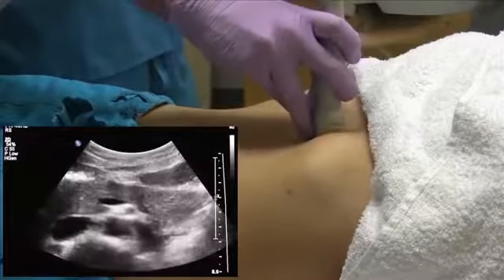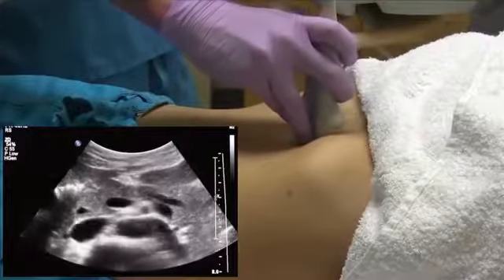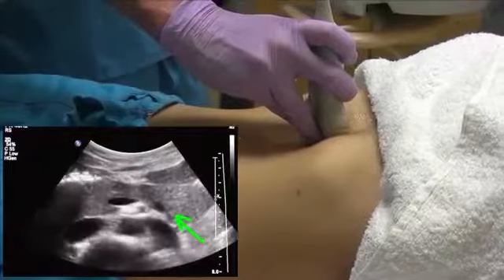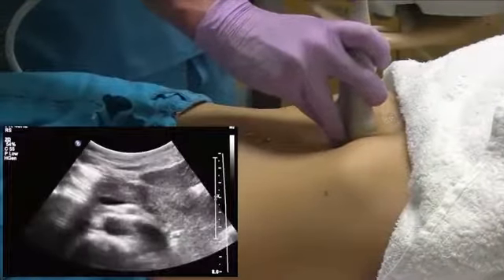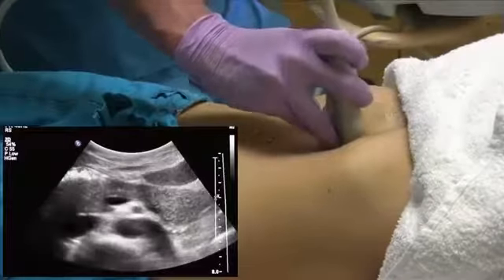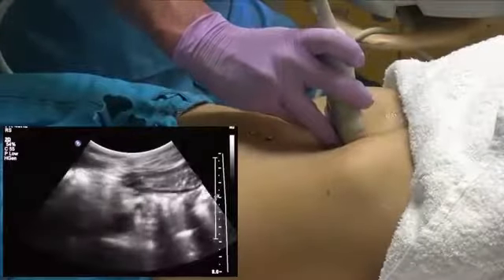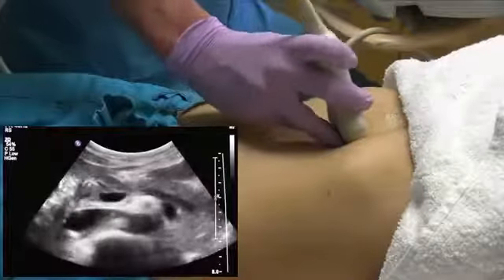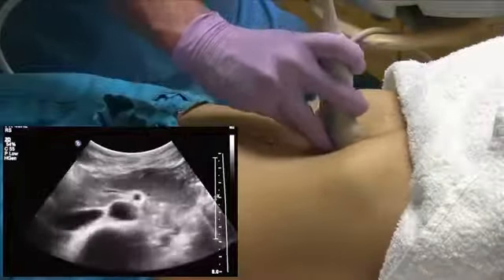If you look at this image here, the splenic vein is a good landmark to let you know that you are very close to, if not exactly on, your pancreas. And like every organ, you need to sweep through. If you just see the splenic vein and take pictures here, you can miss other pathology in the pancreas.